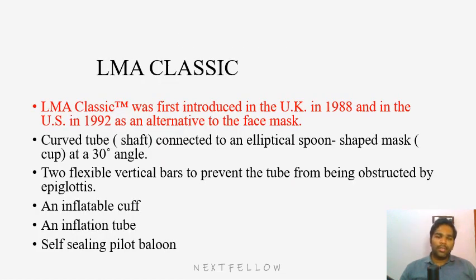So LMA Classic, it was first introduced in United Kingdom in 1988. So we saw the person who invented LMA, who is Archie Brain. And in United States it took some 4 years to accept the LMA. So United States started using LMA by 1992. We started using LMA very much later. Nowadays the LMA is very commonly used.